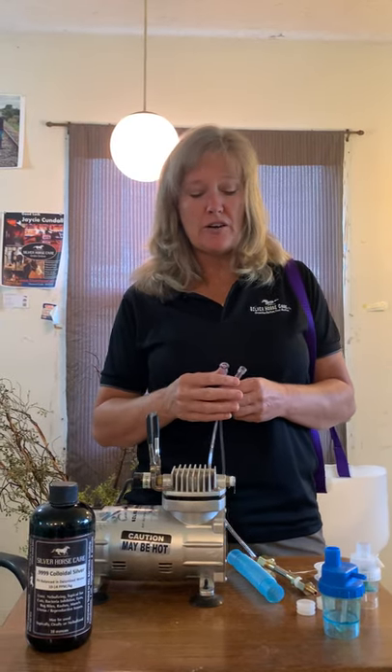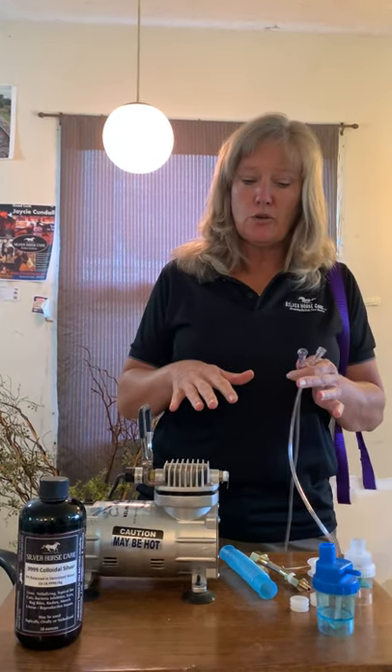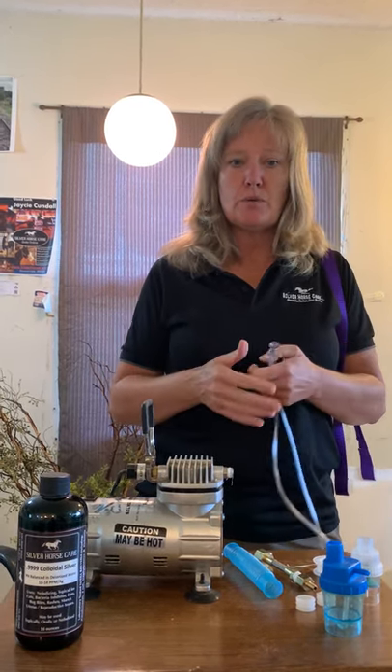Hey everyone, this is Becky with Silver Horse Care, and I wanted to show you real quick about putting together the compressor so that you can give your horse a breathing treatment.